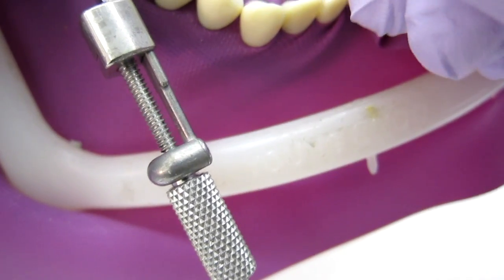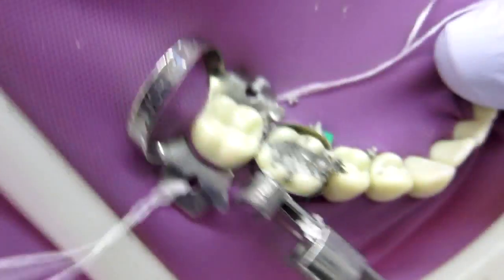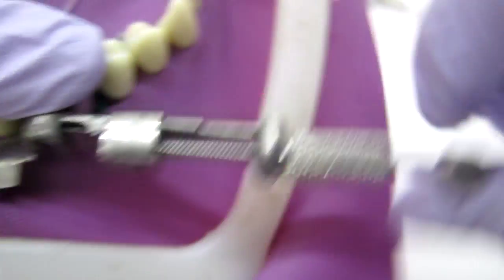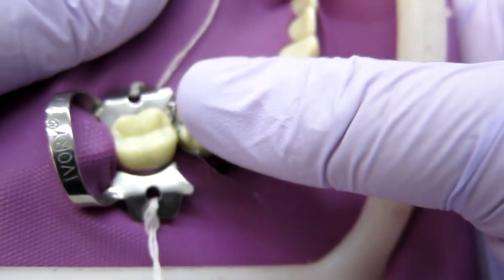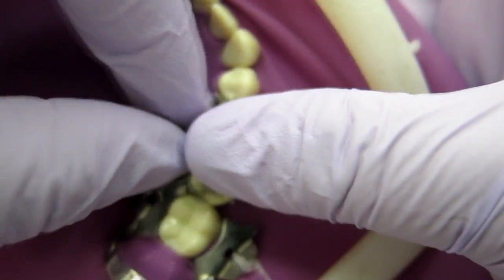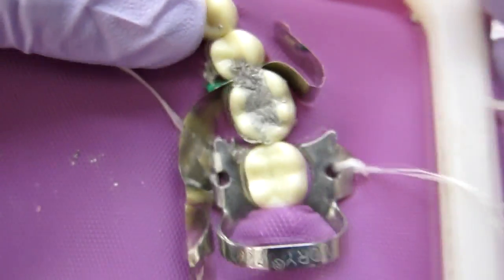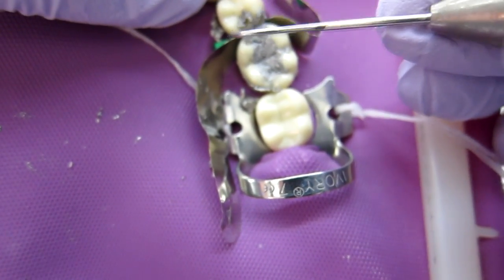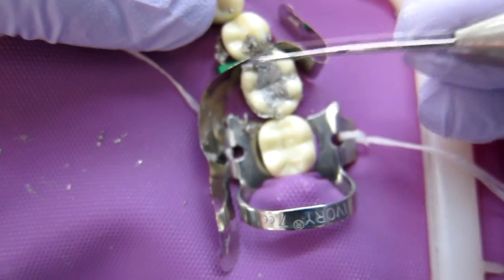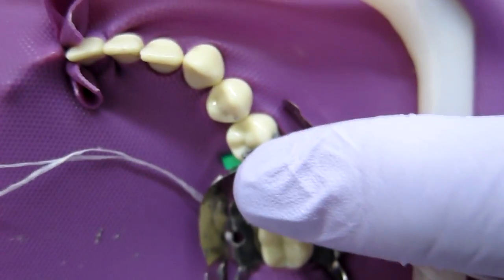Keep that zigzag shape in mind. I've done as much occlusal anatomy as I can with the band on, so I'm putting my thumb over the band and loosening this last one — pull it off. Hold it where the marginal ridge is. If you're doing an MO, pull off the distal part. Be really gentle and make sure there's no amalgam caught between the band and the tooth, because you don't want to pull it off and have your marginal ridge come with it.